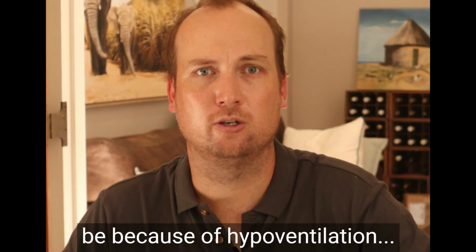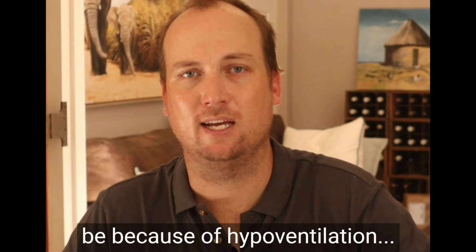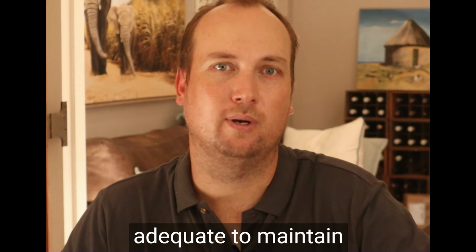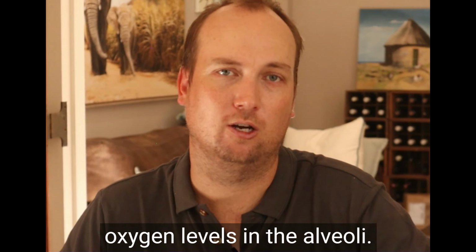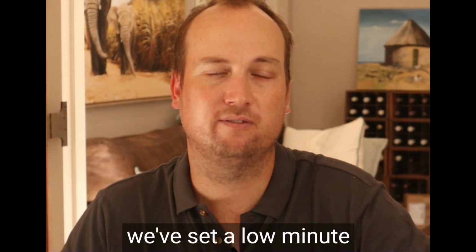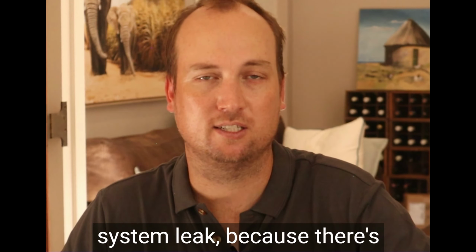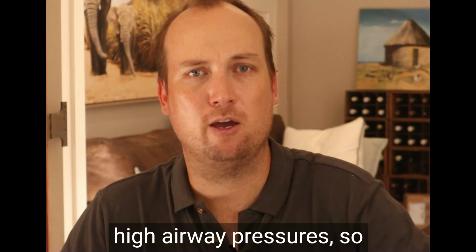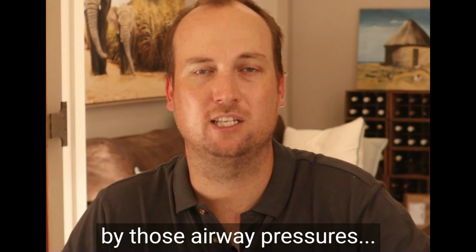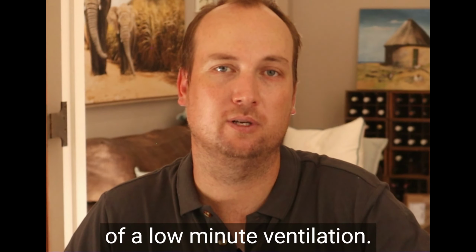Or it could be because of hypoventilation. The minute ventilation of the patient is not adequate to maintain oxygen levels in the alveoli. And this could be because we've set a low minute ventilation, because there's a system leak, because there's high airway pressures, so our ventilation is hindered by those airway pressures. There are a number of causes of a low minute ventilation.